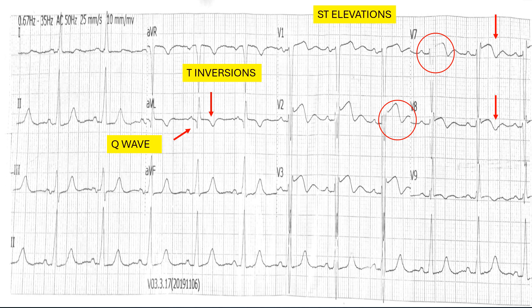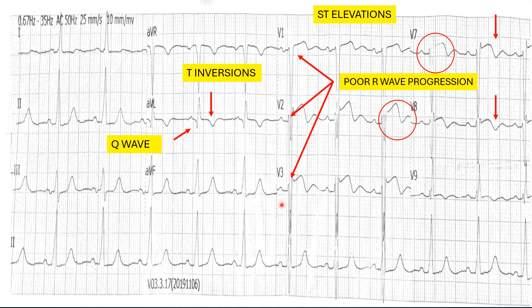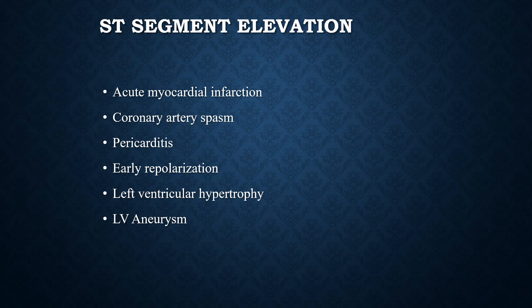In addition to these findings, we can also see some findings that are very important and should not be missed — these are poor R wave progression. In normal healthy individuals, the R wave progresses from V1 to V6 in a healthy way, but here we cannot see a healthy R wave up till V3 and even further. This means there is some effect on the myocardium. Poor R wave progression is a very important parameter, especially when considering ischemic events.